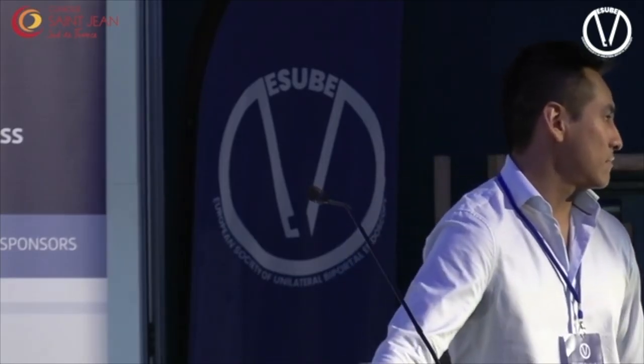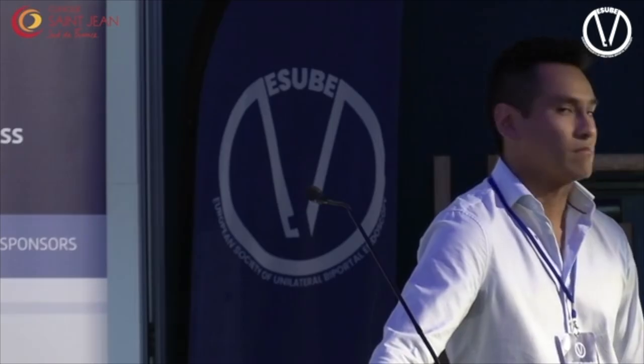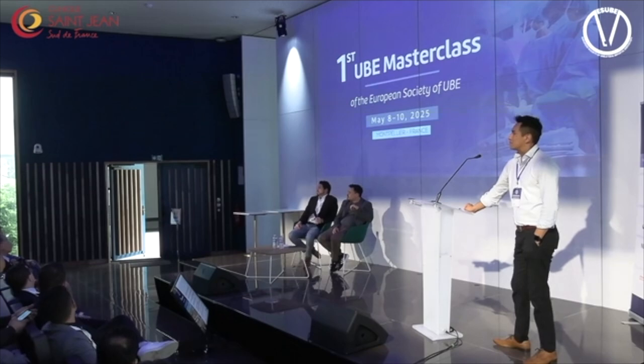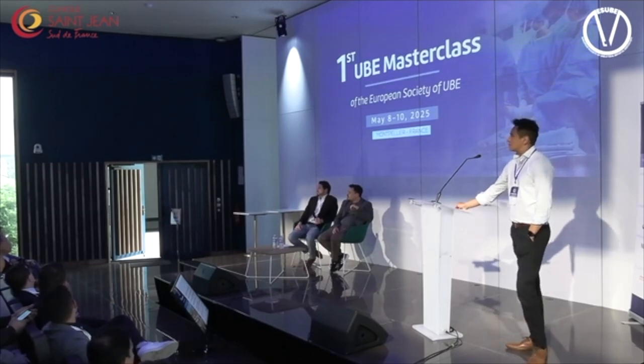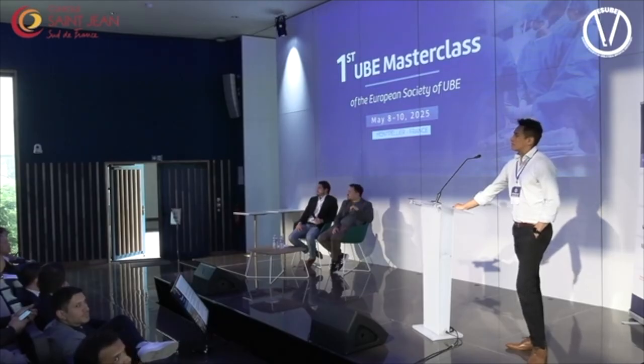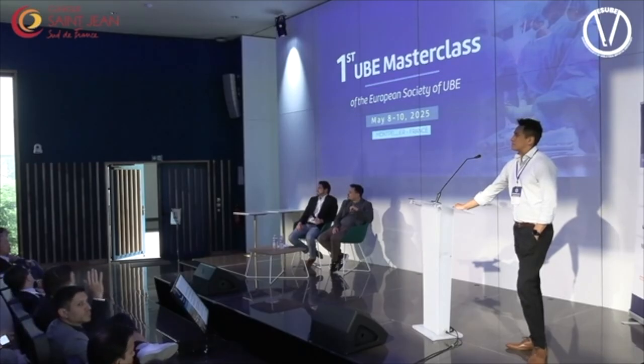Very nice presentation too. In terms of the hematoma, did you put drains in all patients or not? I think you don't put drains. No, this is my 51st case, and at that time I didn't put a drain, but then I moved to using a drain, and I have fewer hematomas. Have you compared the postoperative MRI with the drain? No, because the MRI is at 3 months, there is no more hematoma at that time. But if a patient has some pain, we do a new MRI at maybe 10 or 15 days, it depends. If the patient has no pain, I don't do a new MRI at 15 days.